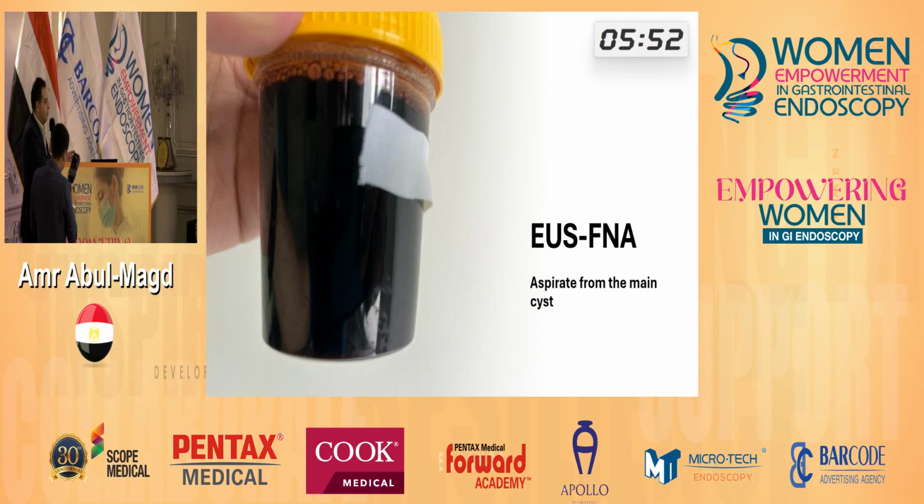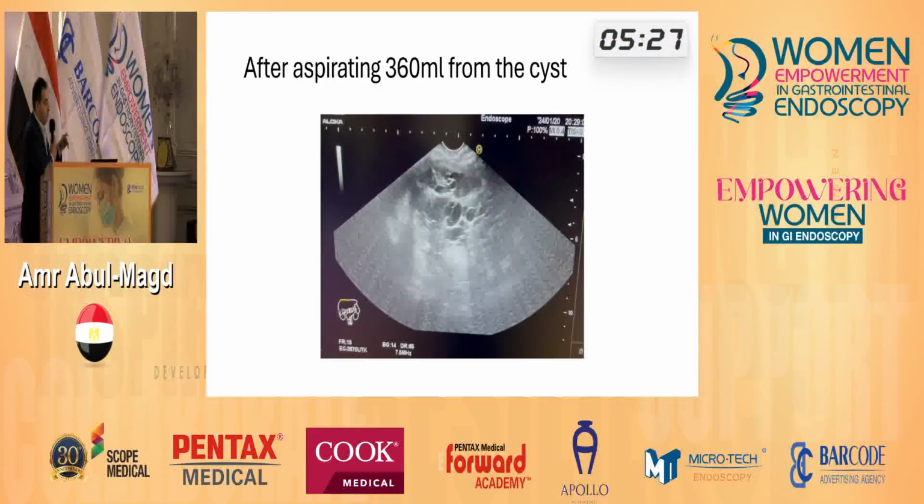So I started to hesitate again. This is the classic view of a pseudopancreatic cyst. The decision will change again, completely restricted to Dr. Amr Al-Fuli's concept. This is not the feature of a pseudopancreatic cyst, and I started to completely aspirate this cyst fluid.